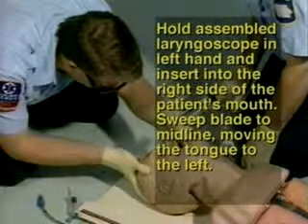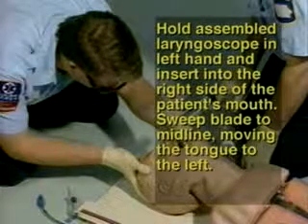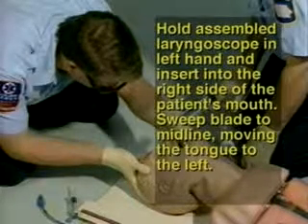Step 8: Hold the assembled laryngoscope in your left hand and insert it into the right side of the patient's mouth. Sweep the blade to the midline, moving the tongue to the left.